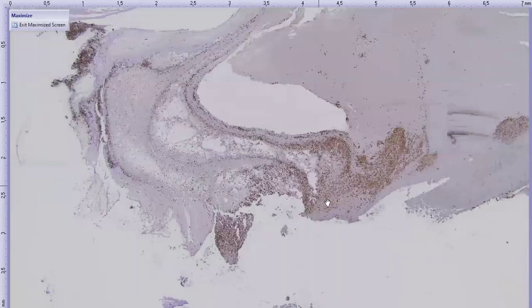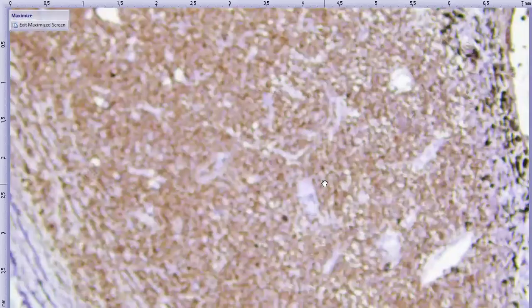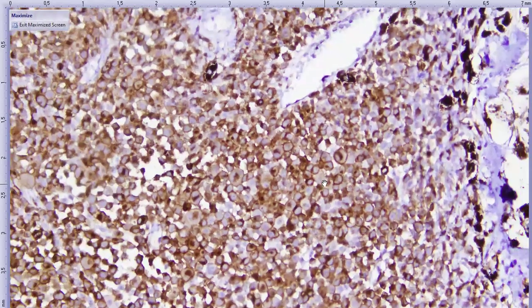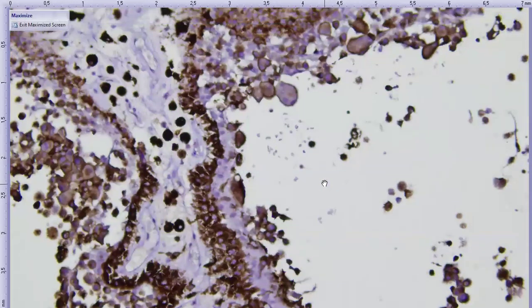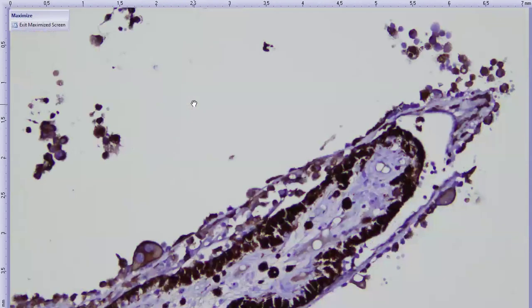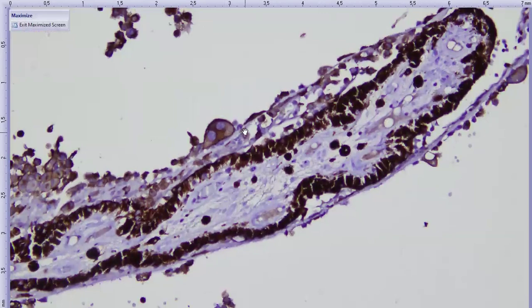You can see even the necrotic cells in the vitreous were positive. And then we have nice positive staining for the CD204, confirming histiocyte origin, and this is histiocytic sarcoma. So even our big multinucleated cells. Here's a nice one, a little alien crawling along the ciliary body here.